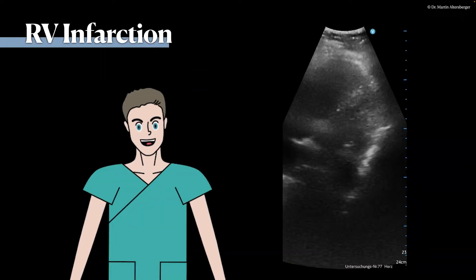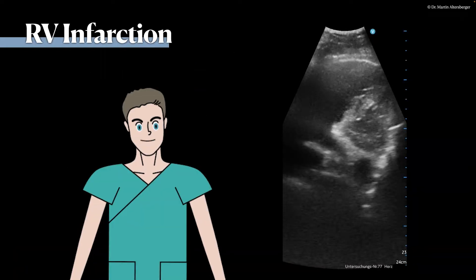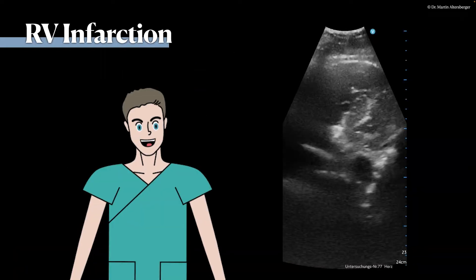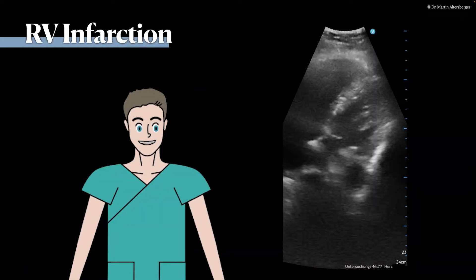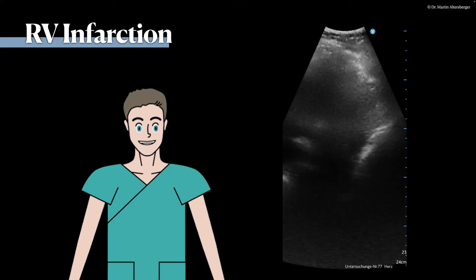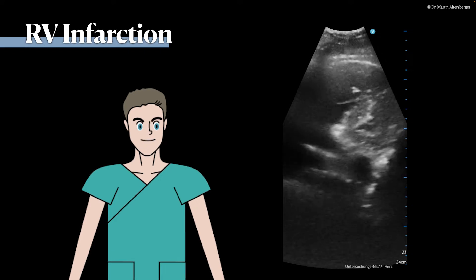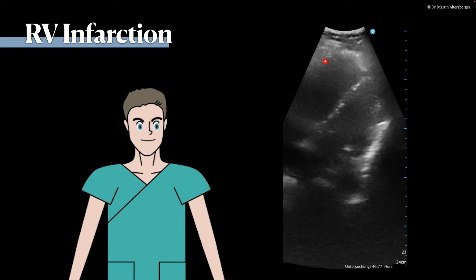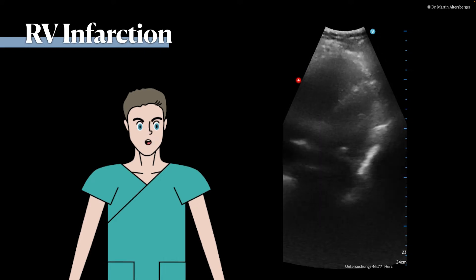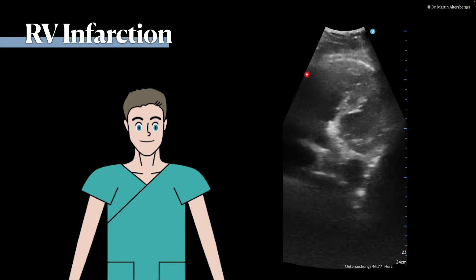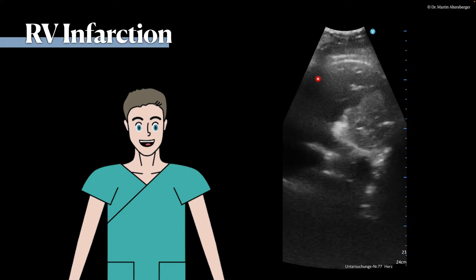What is the problem here? This was a case of an isolated right ventricular infarction. The parts of the right ventricle we can see are akinetic.